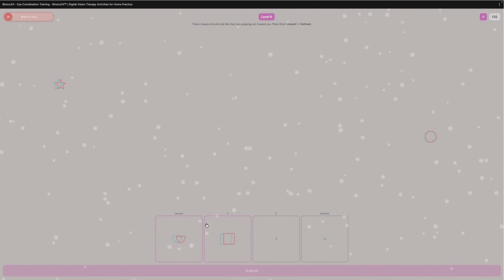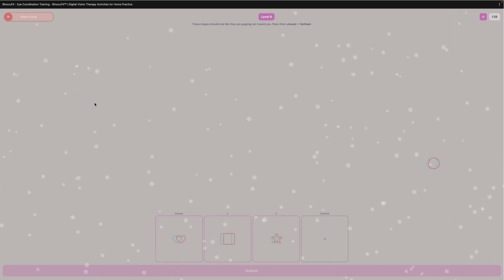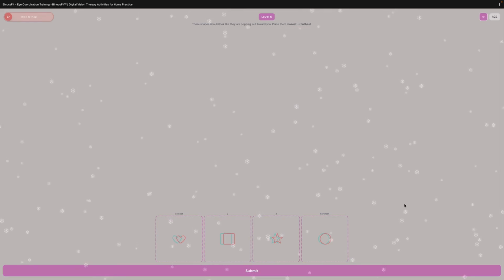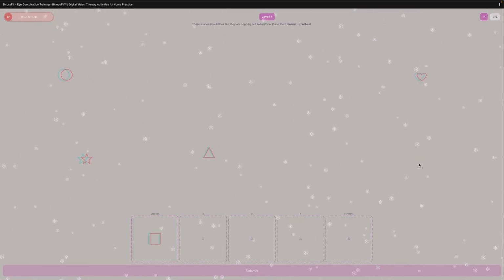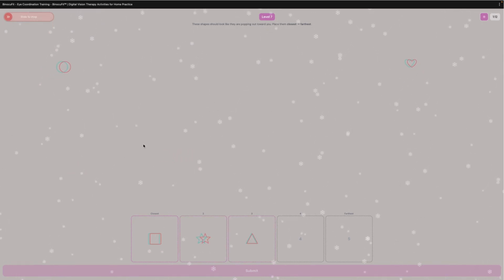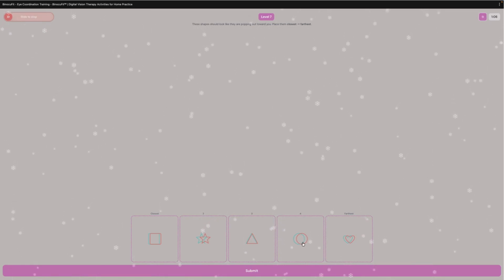I do find that making these judgments is something that I've worked on with patients in therapy over the years. And I do feel like it really helps to bring things into the real life where we're consistently making judgments, small, teeny tiny judgments about which step is closer. Like, how do I step over that curb? Which object is closer to me? Which car is closer to me? How am I going to navigate the world based on really precise and quick and efficient small judgments?